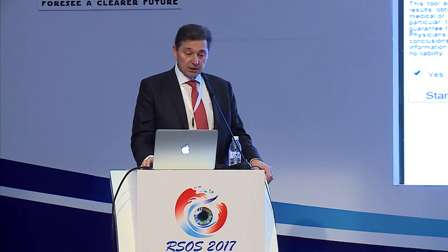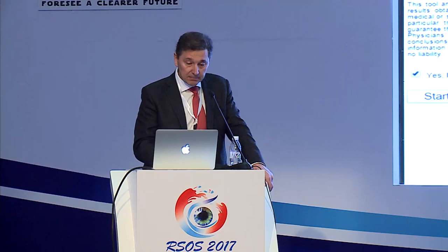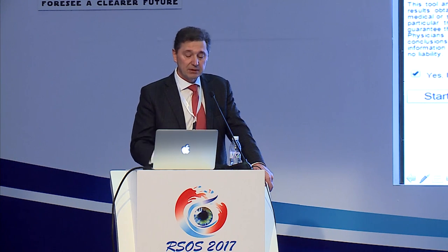So how high can we go with a WaveLight laser? Well, I'll show you what my nomogram says. We can do up to plus 6 on the laser, and I've got data for plus 1 to plus 2, plus 2 to plus 3, plus 3 to plus 4, plus 4 to plus 5, plus 5 to plus 6. What you see at the bottom is my nomogram. So if I want to correct plus 5, I need to enter plus 4.73 on my laser.